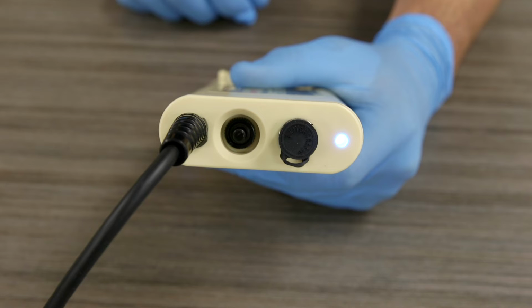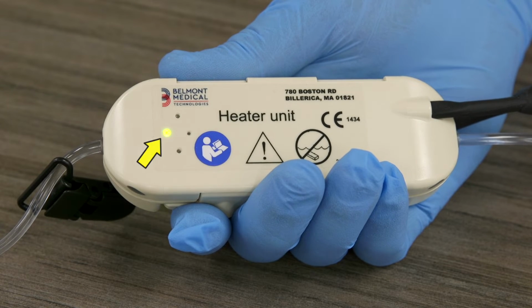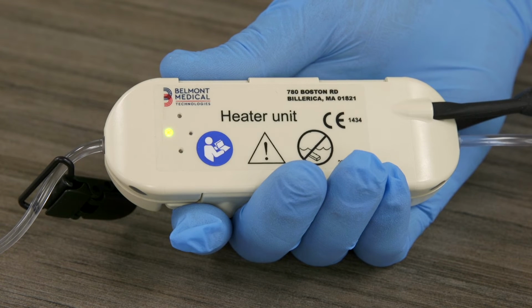Observe the LED on the battery housing. The LED is blue when the battery is powered on. The green LED on the heater unit will flash with each heating cycle. The Buddy Lite will analyze input fluid temperature and automatically make adjustments to achieve a target output fluid temperature of 38 degrees Celsius.